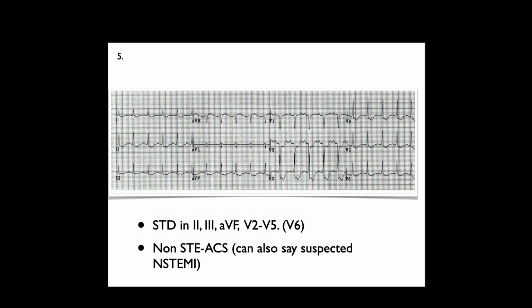Yes, Kyle? Not that the ST depression in V3 and V4 isn't completely obvious, but would that still be considered a Wellens sign too, with the T's upside down? No, because Wellens is up first, down second. I was just talking about the inverted T waves. So what you're saying is, if there was no ST depression, it might be Wellens?